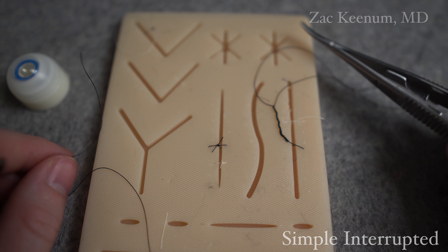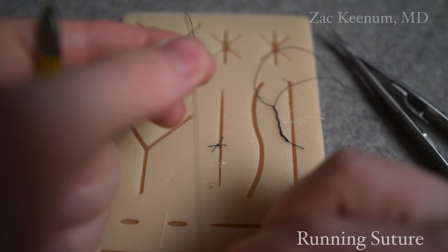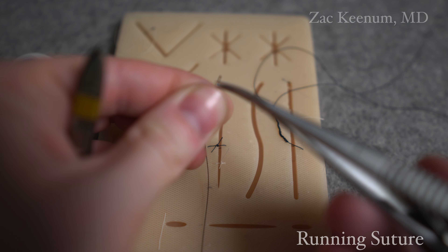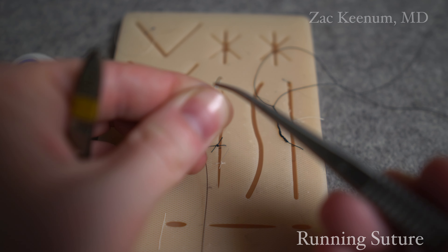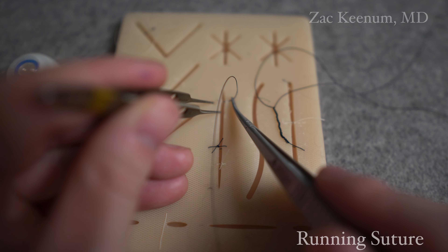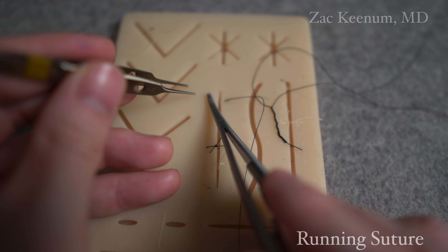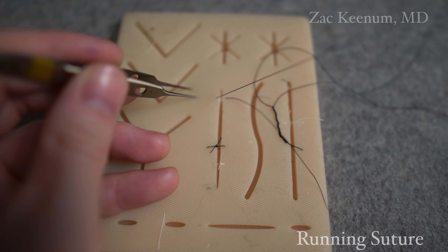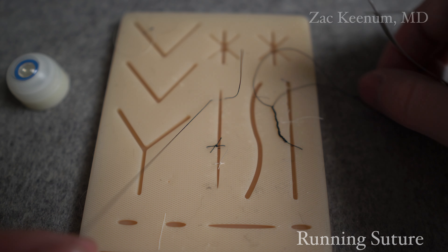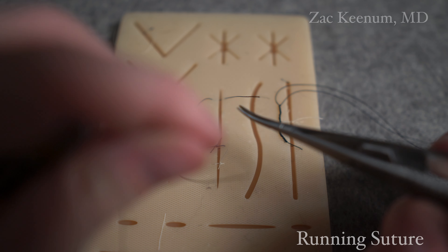I can continue to do that throughout the wound if I want. Let's move on to running suture. I'm getting ready to load the needle. I grab it, pull it through my fingers - I have good control of it. I want a forehand, so I'm going to face it down. Funny ducks - FD. We start the same way at the end of our wound. Typically with a running suture, I like to suture toward myself. It's easier to suture toward yourself. I'll show you how to one-hand tie at the end.